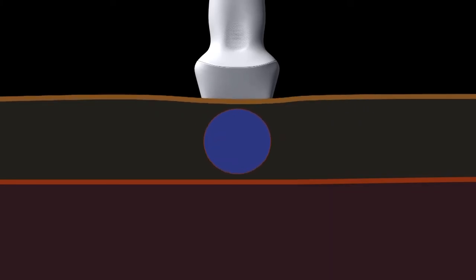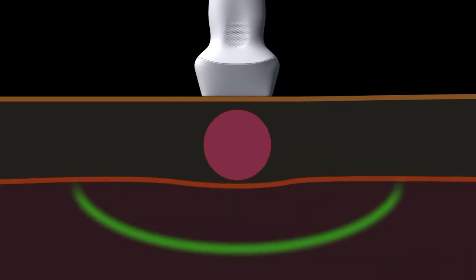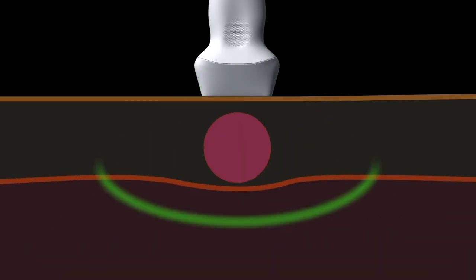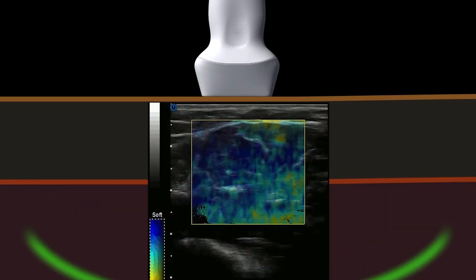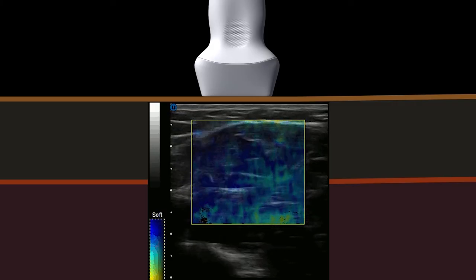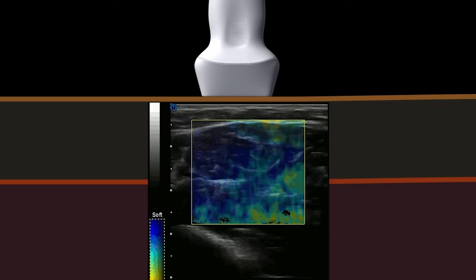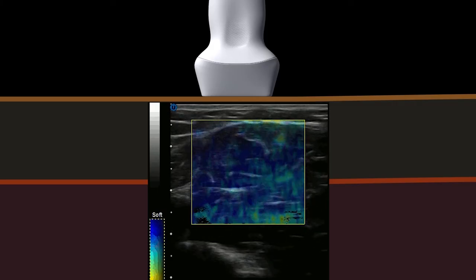This compression was originally done manually, but newer elastography systems send out high-pressure pulses that compress target tissues by a predefined amount of force and display the resulting compression levels in various coded colors.